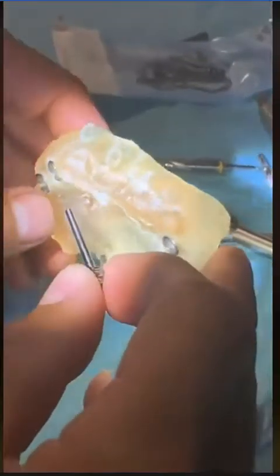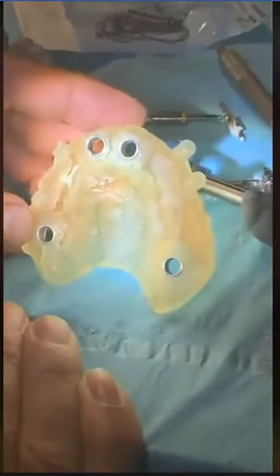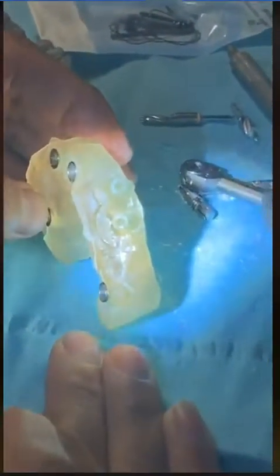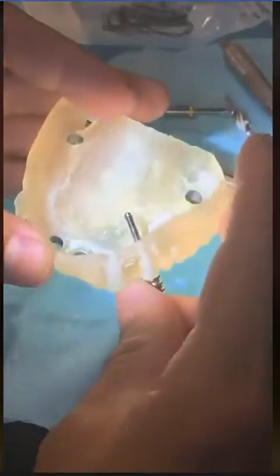This surgery was done yesterday, and I did it in a friend of mine's office where he likes to place MIS implants. So I basically made a surgical guide from Blue Sky Bio. I follow our Blue Sky Bio protocol. The size of the implant is pretty much the same, okay? But the fixation pins are what actually holds things in place. This is the patient's denture.